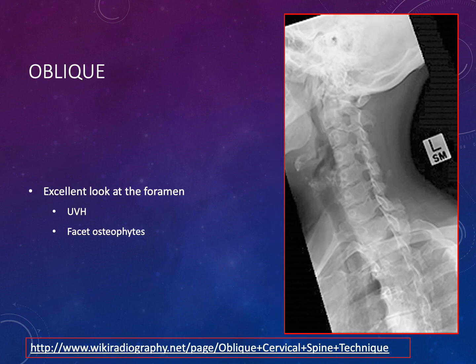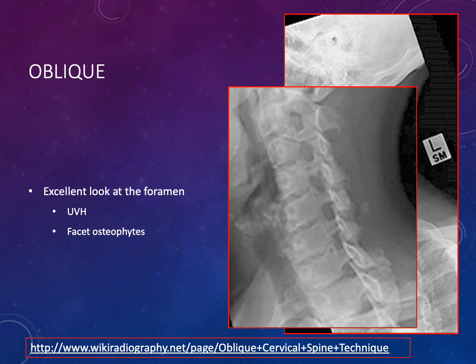The real winner among these views is the oblique view. A left oblique view lets you look at the right foramen, and a right oblique view lets you look at the left foramen. These views help assess the uncovertebral joints and foramina. You can see uncovertebral spurring at the inferior aspect of the foramina, and facet arthrosis posteriorly. When both are present, there is deformation of the foramen, making this a great way to identify bony foraminal stenosis.